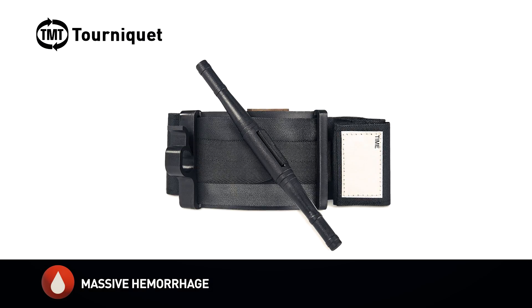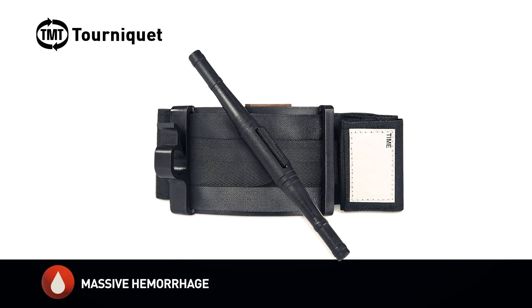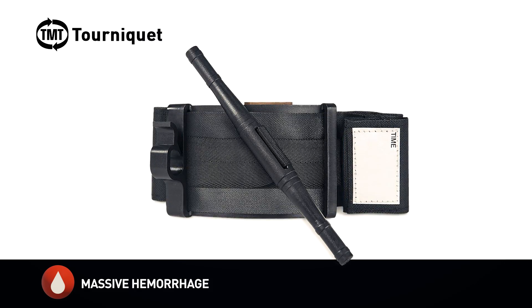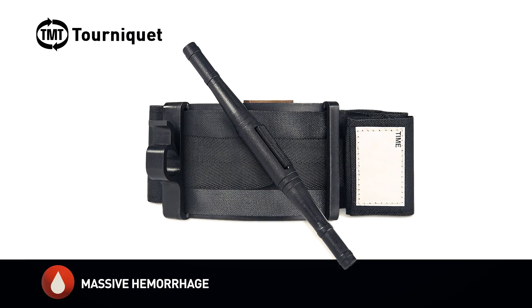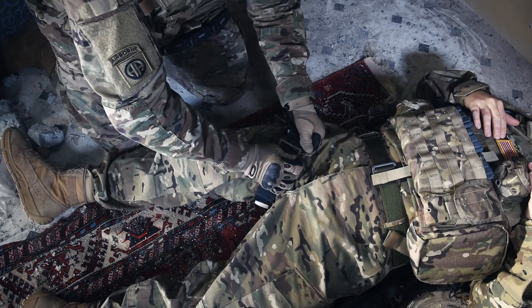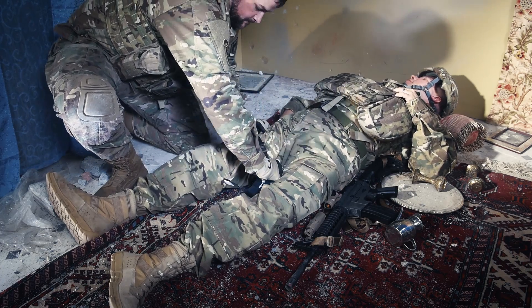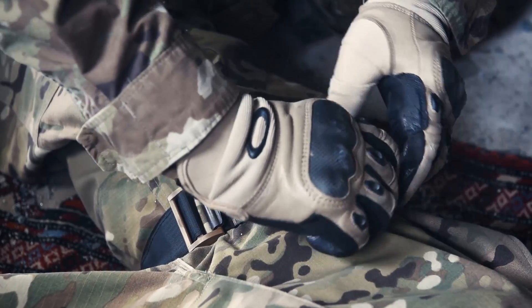The TMT tourniquet is the newest military tourniquet to be adopted by U.S. military units, law enforcement, and first responder professionals for extreme, tactical, and emergency environments. The TMT tourniquet has undergone multiple military tests and field evaluations for durability and efficacy and has been shown to have superior performance.